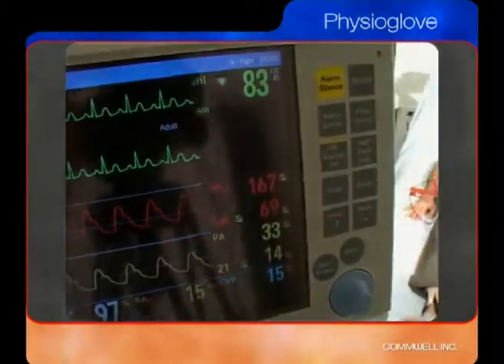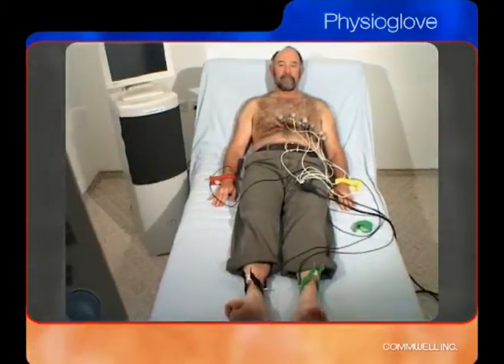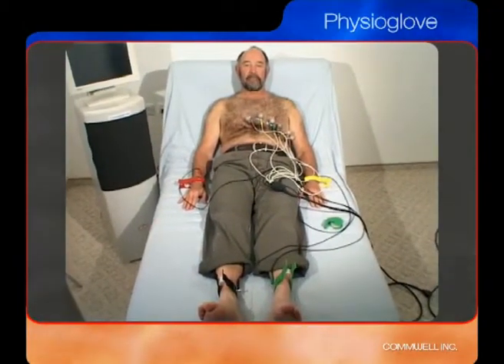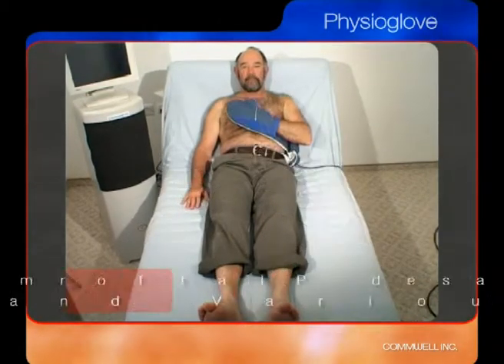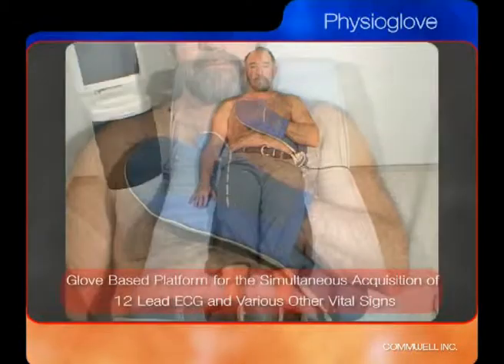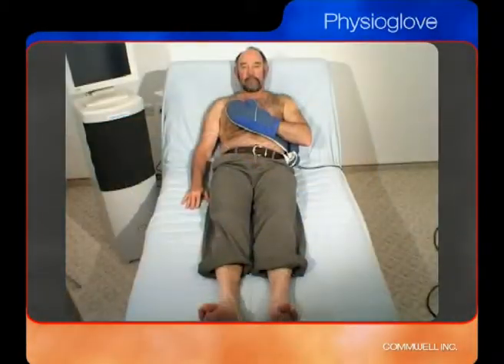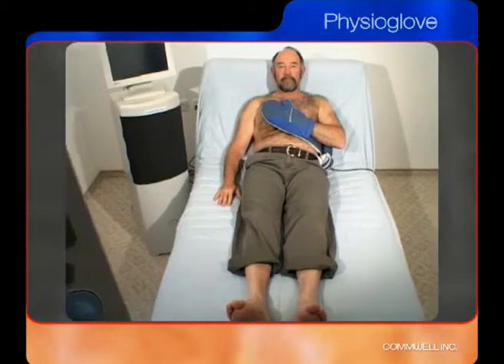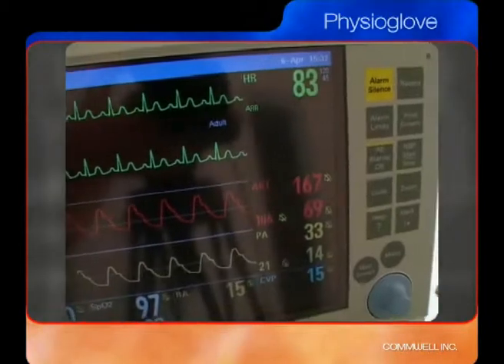In the world of electrocardiography, evolution is constant. Revolution is rare. Introducing Comwell's Physioglove, a unique glove-based platform for the simultaneous acquisition, storage, and transmission of 12-lead ECG and numerous other physiological parameters. Welcome to the new world of capturing vital signs.